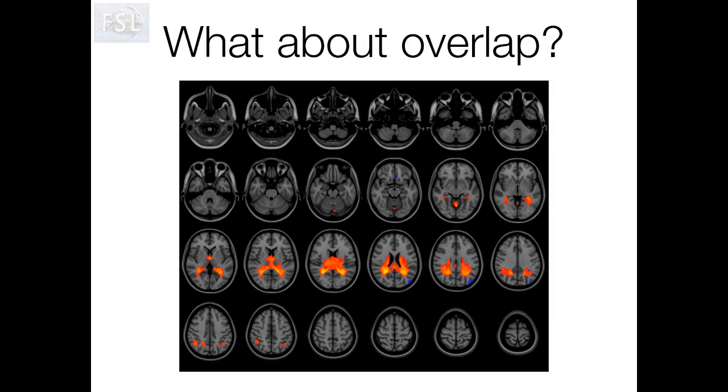There's one more technical issue which we need to consider when applying ICA to fMRI data. So you recall that ICA extracts spatially independent components. This means that ICA tries to maximize the spatial independence so that there is as little similarity in space between components as possible. Intuitively, though, this doesn't sound like a very good approach, because we know that a single brain region can be involved in many different networks of activity. So if we're trying to make our components as spatially independent as possible, how could the involvement of such a region of integration in different networks be captured?